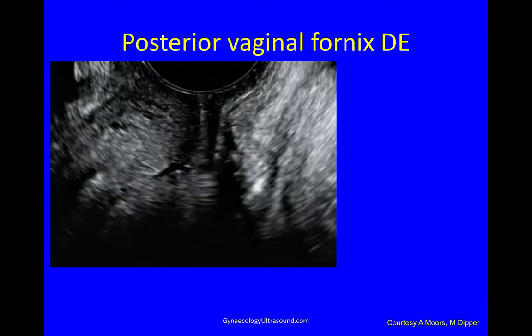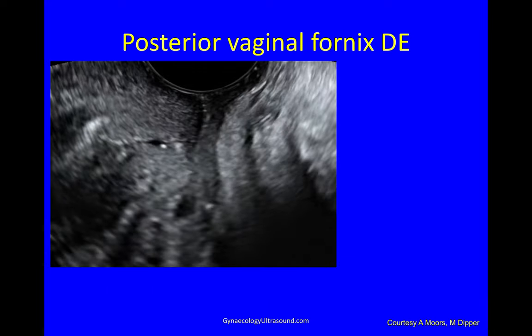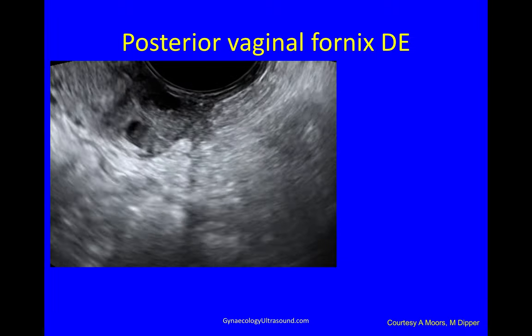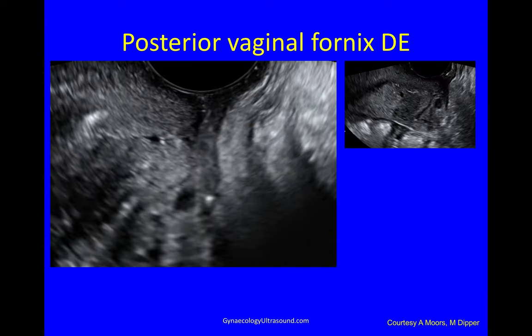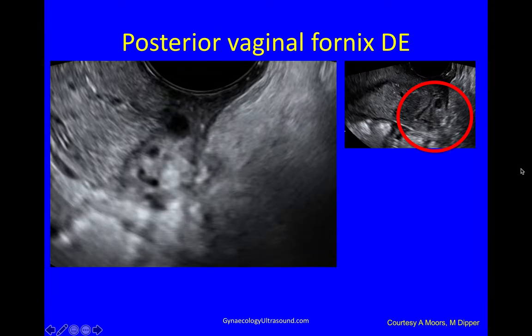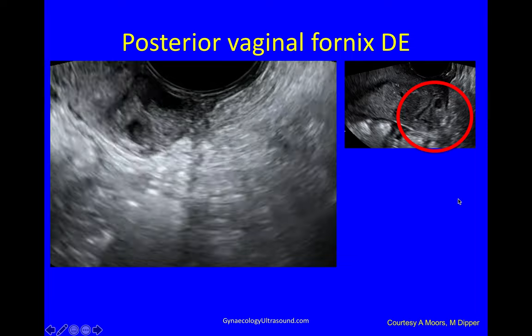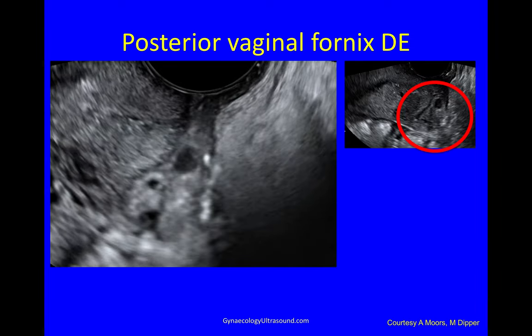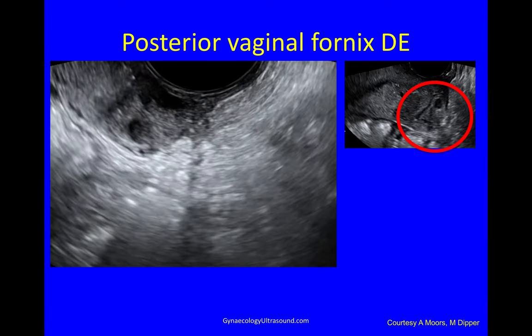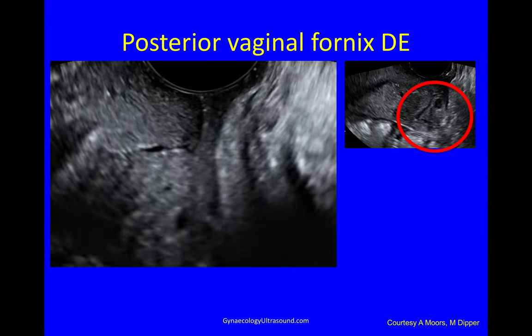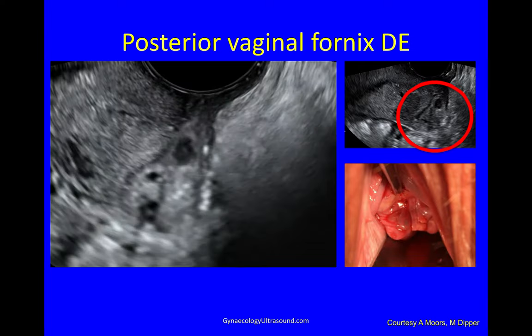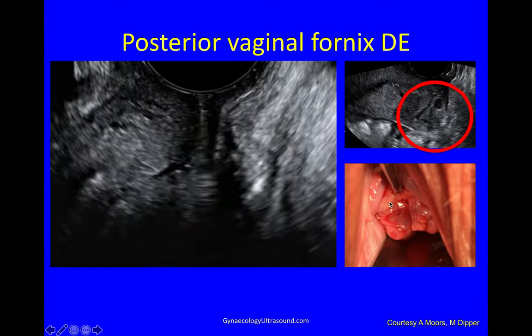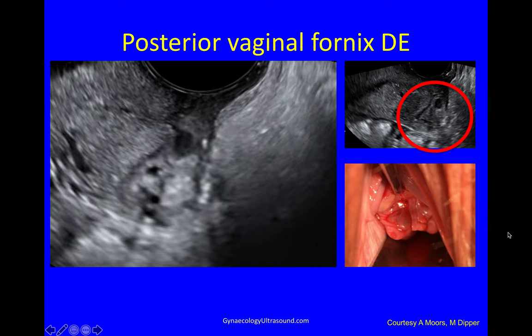Looking at the vagina: with the transvaginal probe being inserted just behind the cervix, you can see a nodule of deep endometriosis actually in the vagina. If you don't look while you're putting your probe in, you'll miss it — you've got to look when inserting the probe. Here the posterior vaginal fornix is abnormal, and on speculum examination you can just see this bluish nodule through the epithelium, but you could miss that.